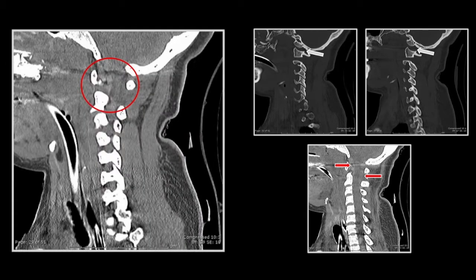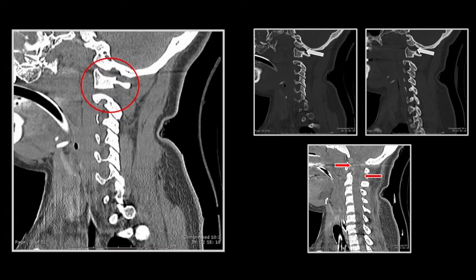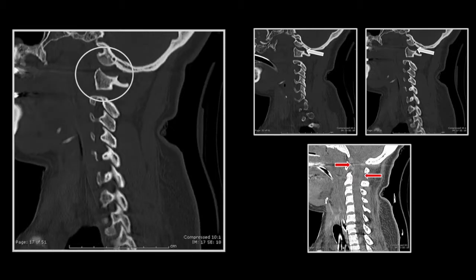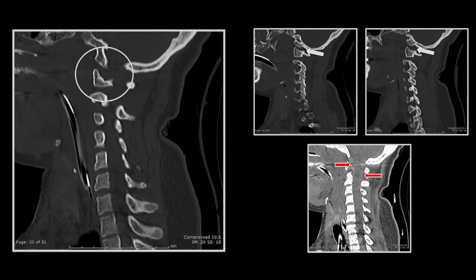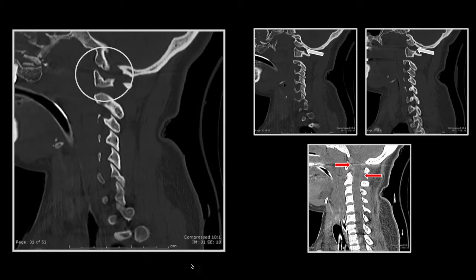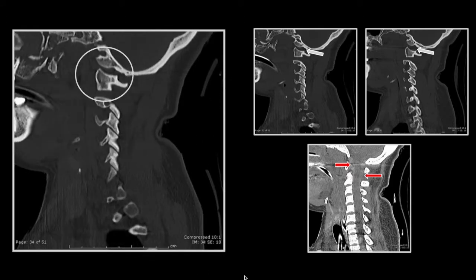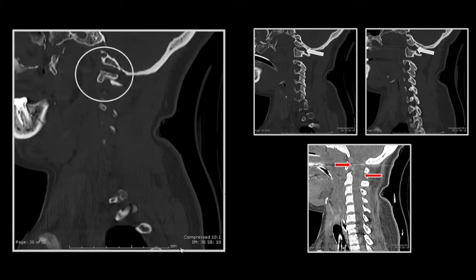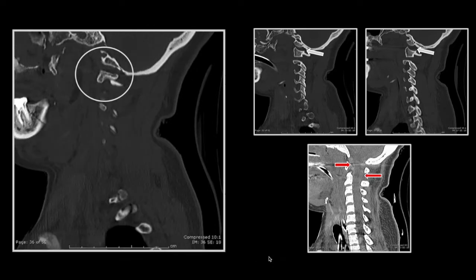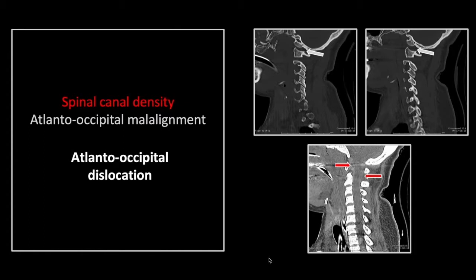I don't believe I've ever seen an atlanto-occipital dislocation that did not have extensive epidural hemorrhage. You can see the unseated condyle on the near side and the far side. Note the pterygoid and mandibular fractures present on that side as well. That is an atlanto-occipital dislocation — nearly always a fatal injury and typically associated with epidural hemorrhage.